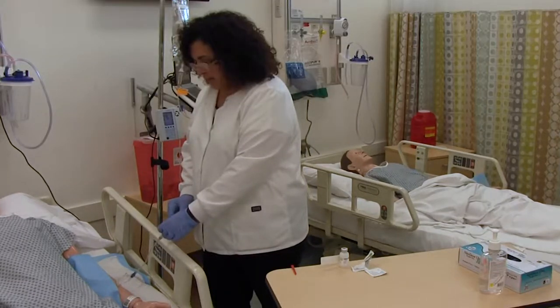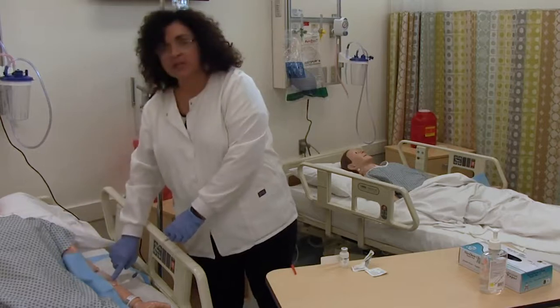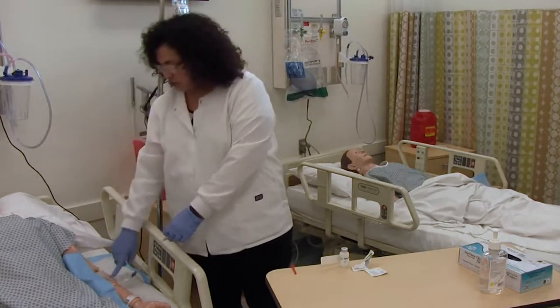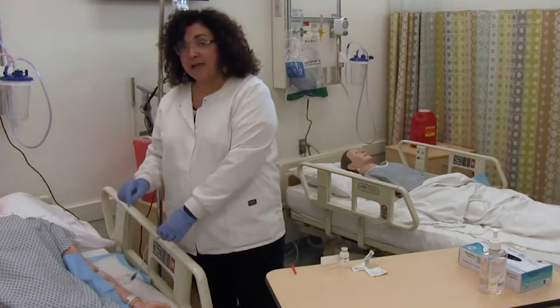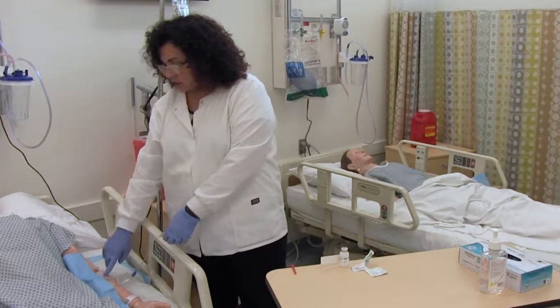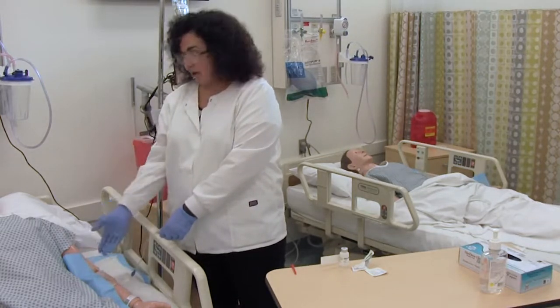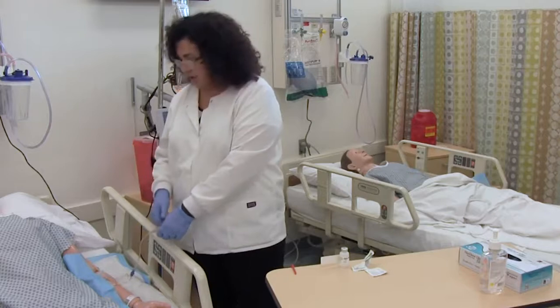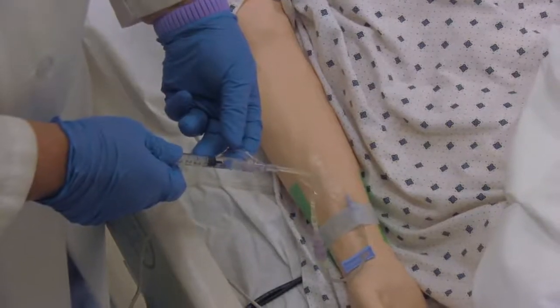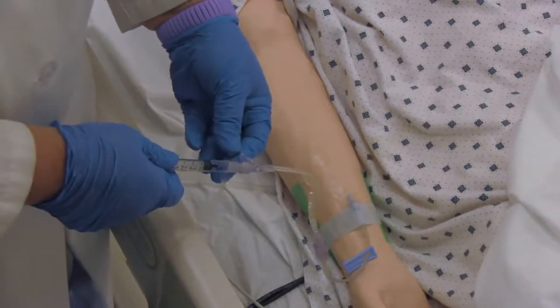So we're pulling back on the plunger, and we're looking for a little flash of blood in our saline lock here to reassure us that this is in fact going into the bloodstream, that this is a good IV, that we're not on the front end of an infiltration or something along those lines. So we pinch our tubing just above the Y site, we aspirate. We see a nice flash of blood.